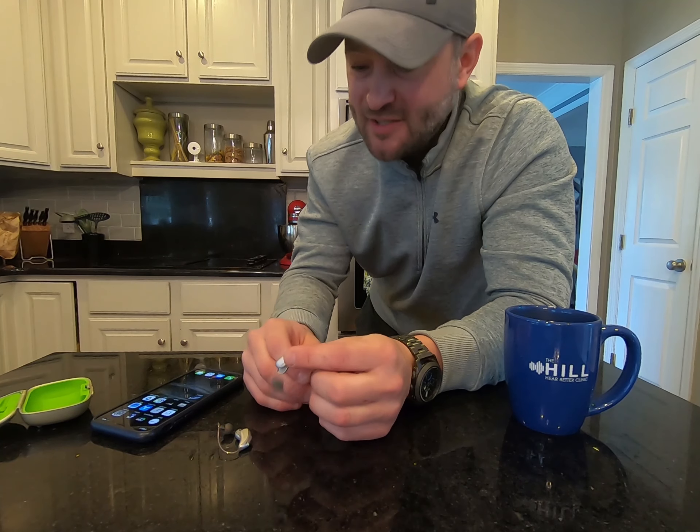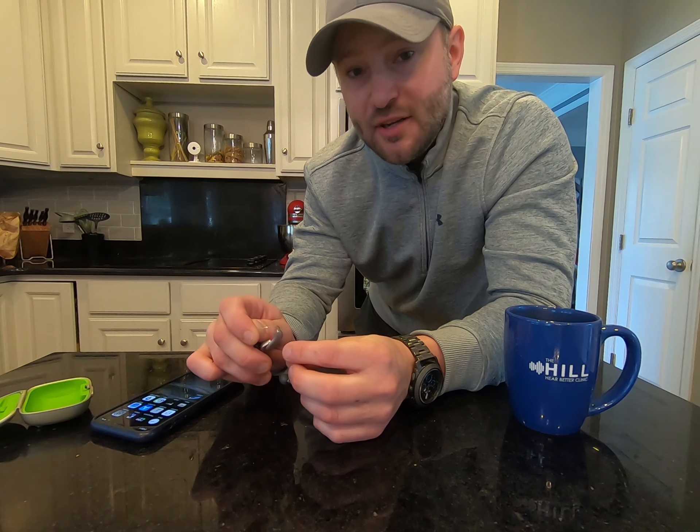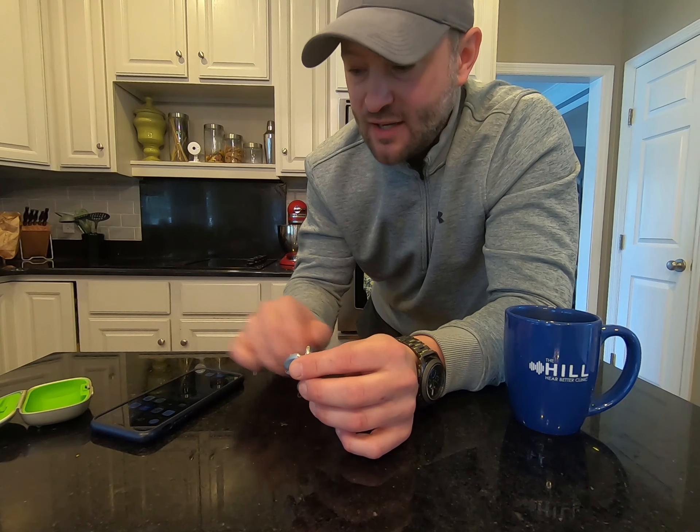Hi folks, Ryan Hill here. Dr. Ryan Hill out of Cincinnati, Ohio with the Hill Hear Better Clinic. What we are going to do today is show you how to connect your Phonak hearing aids to your iPhone.